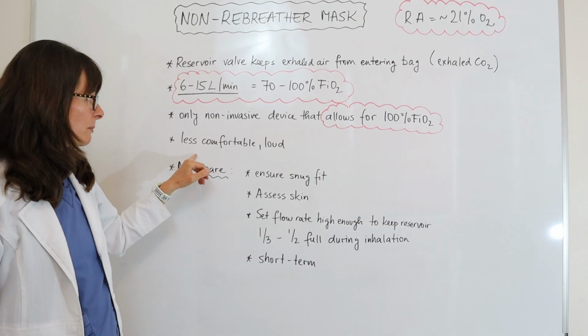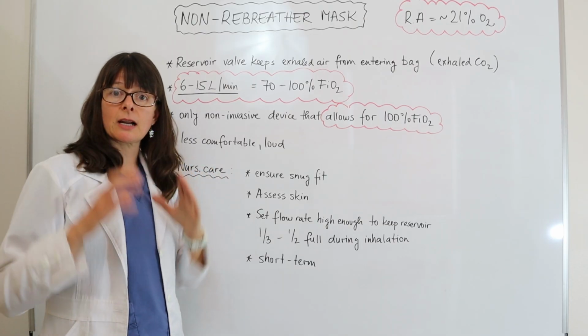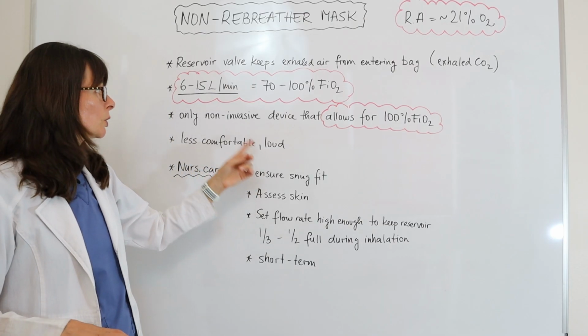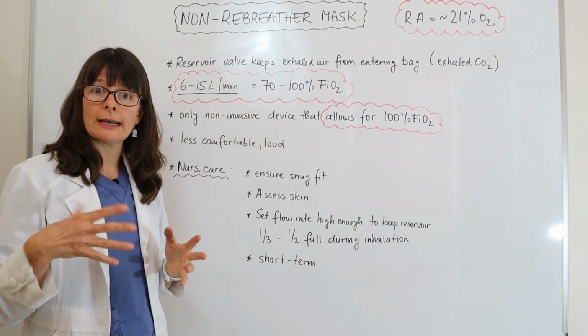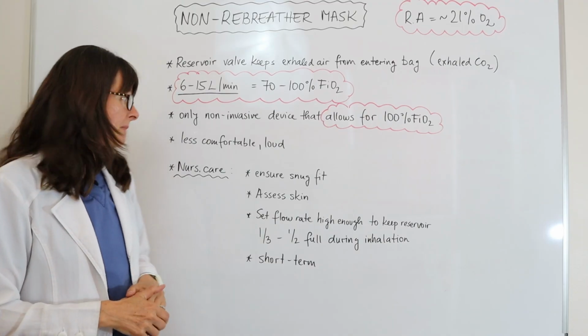It is a little bit less comfortable because it is a mask that covers the nose and the mouth, and it is loud because the oxygen administered at 6 to 15 liters can be quite loud because of the sizzling noise that it makes.